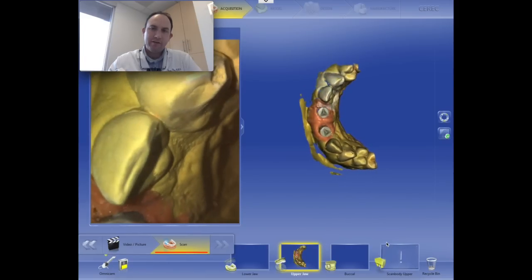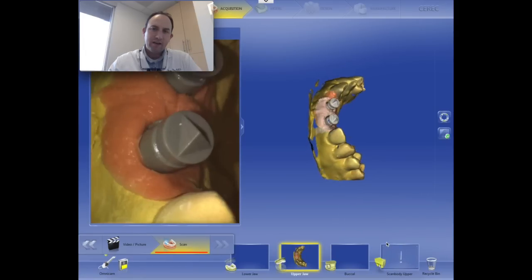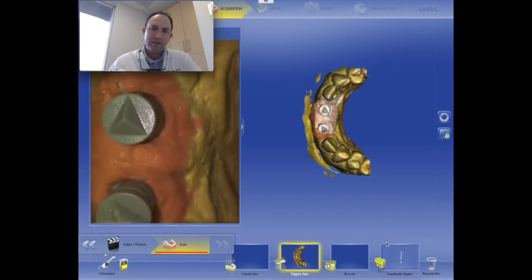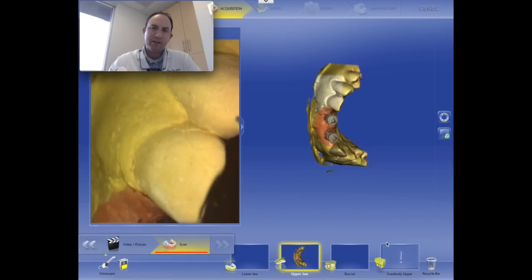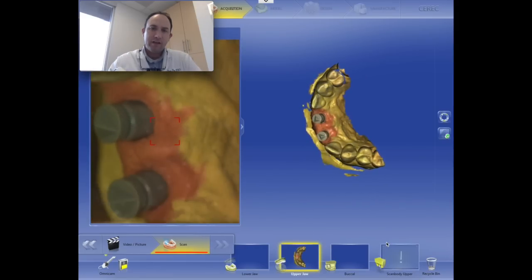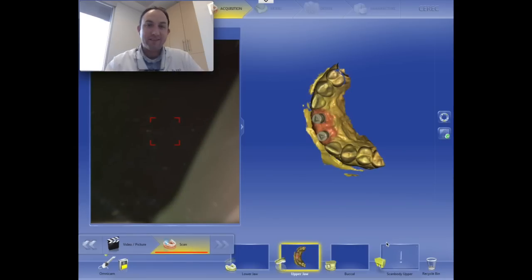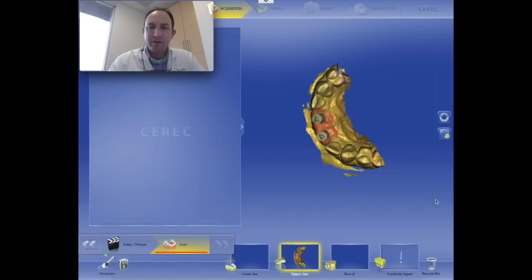I've learned through the years that less is more when we're scanning. Now that comes with some warnings. You always want to make sure you have a very solid imaging set of the tibases, in particular in the area that you're restoring. But everything else you can literally, not literally, but you can skip some of that. Let's turn that off so it doesn't click so much.